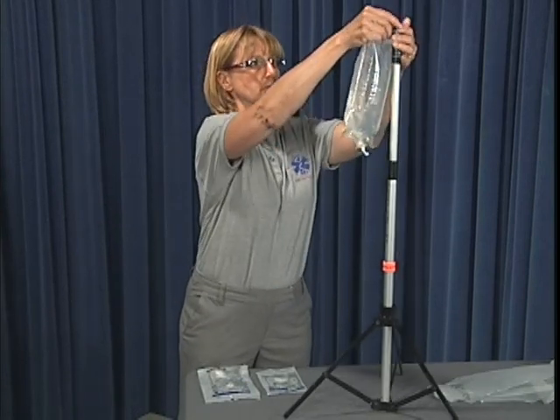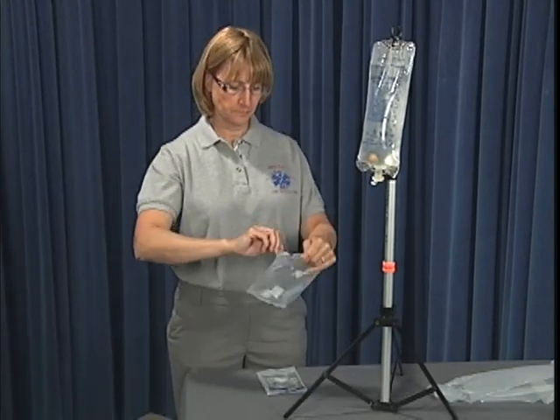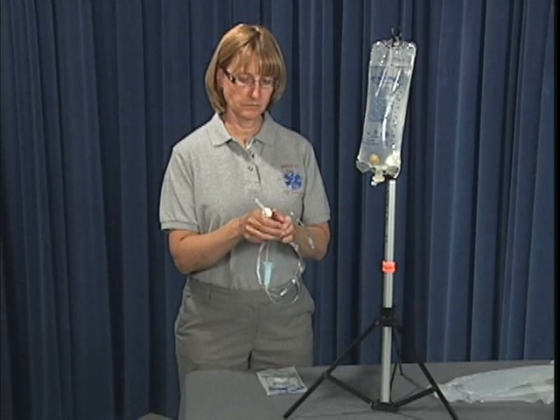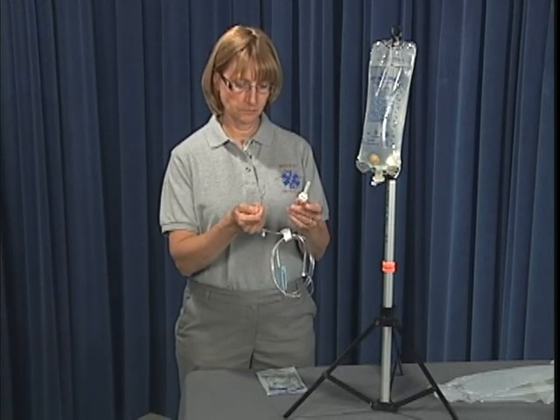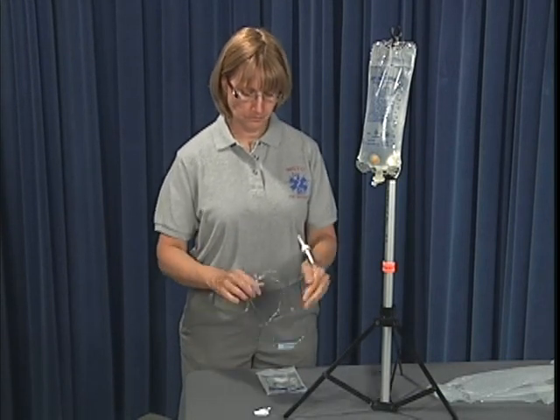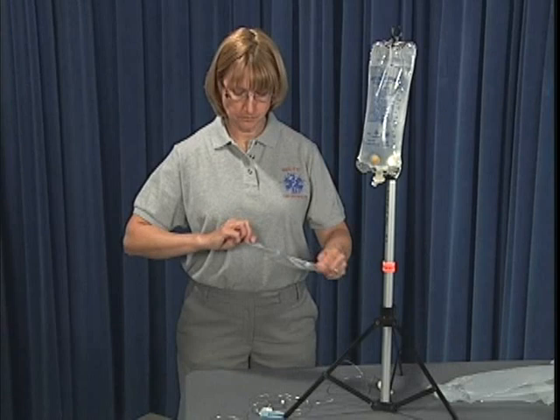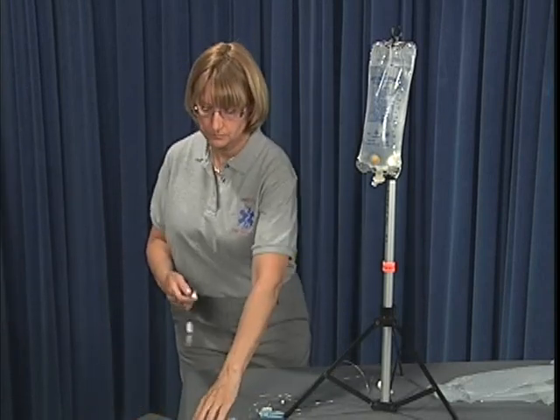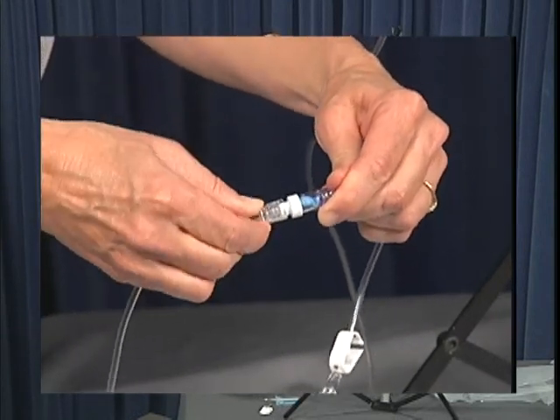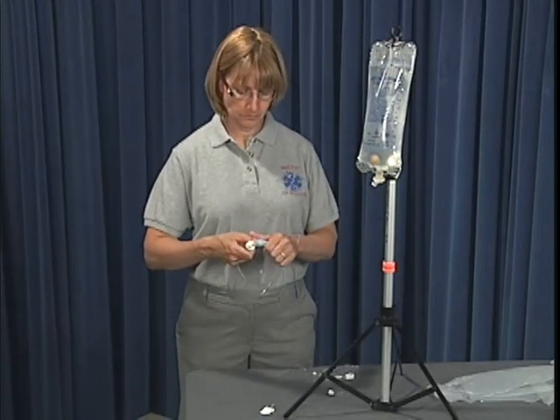Whenever possible, the IV bag should be hung in a vertical position with the tail ports extended downward to facilitate preparation. Open the appropriate administration set based on the patient's condition, ensuring the end caps remain in place to preserve the sterile field. Uncoil the tubing in preparation for spiking the IV bag. If adjunct devices such as extensions are to be used, open and attach them to the administration set at this time.